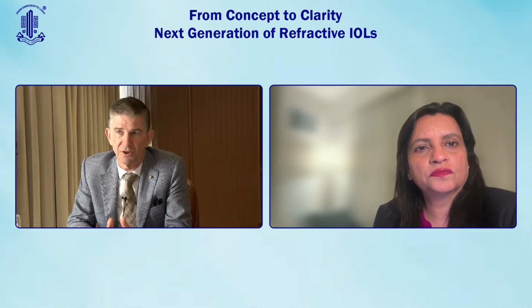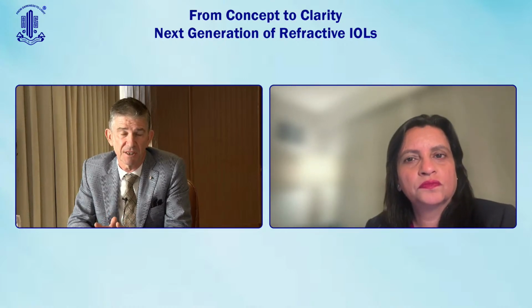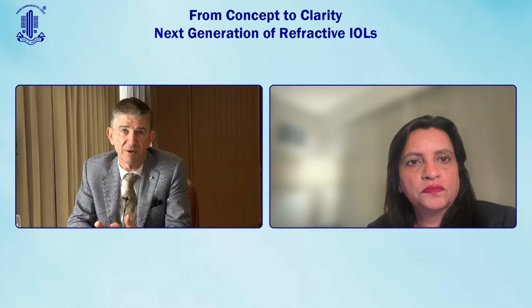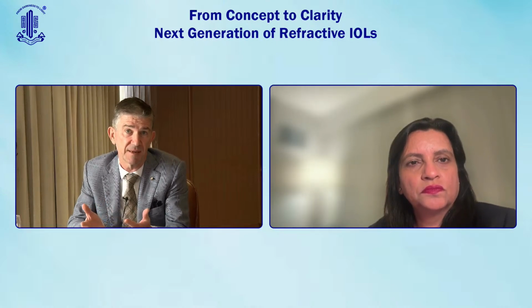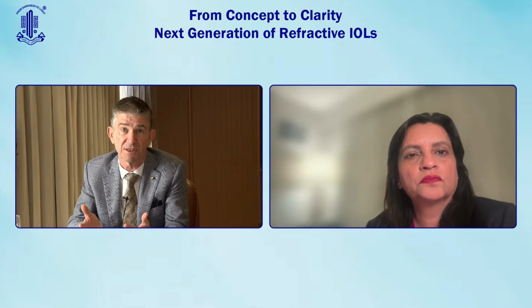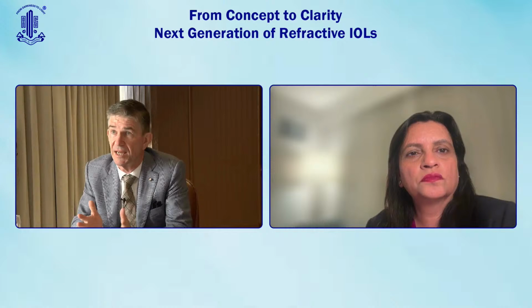Historically, the concern is someone who's got some kind of macular disease, whether it's early macular degeneration, an epiretinal membrane, or diabetic disease, is that using a presbyopia correcting lens was associated with a drop in contrast sensitivity. And these unhealthy maculas do not benefit from a drop in contrast sensitivity. But if we trust the data, the Pure C has the same contrast sensitivity as an Eyhance or as a monofocal lens. So I now don't think there's a contraindication to using Pure C in these cases.